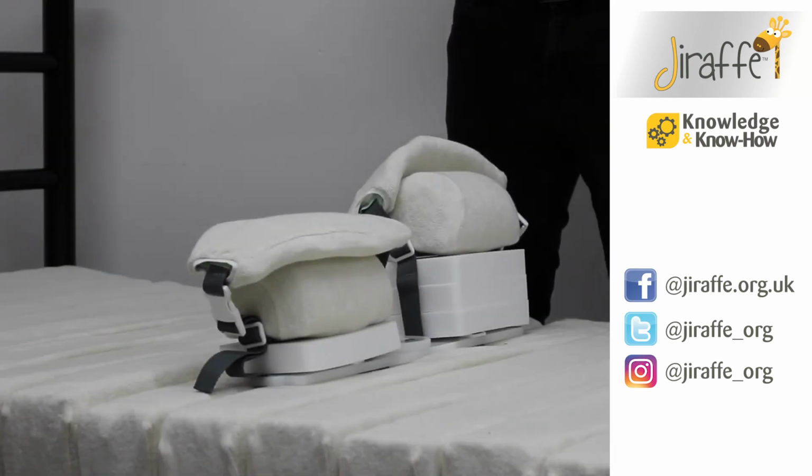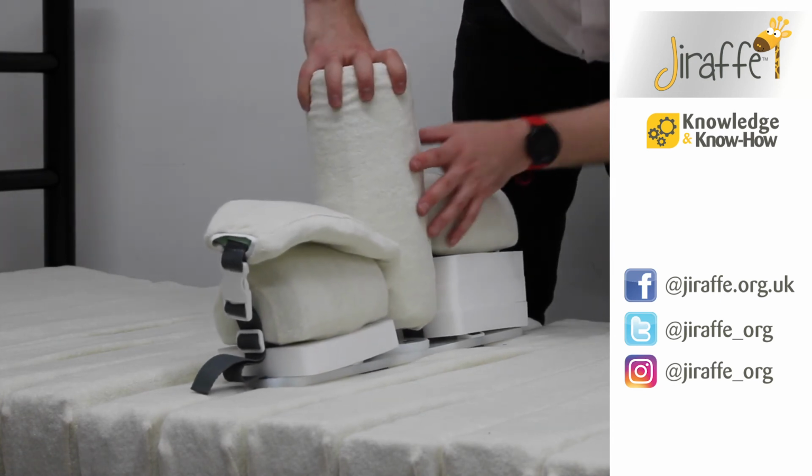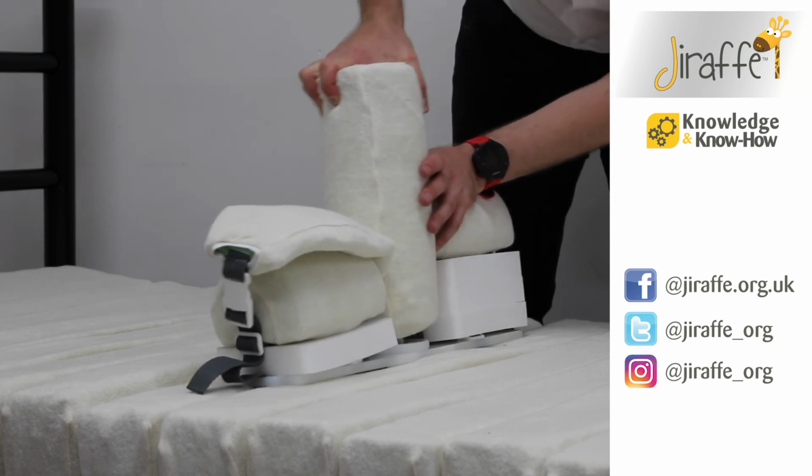We can return the abduction block by simply fitting it into the centre of the T-roll and twisting it into place.